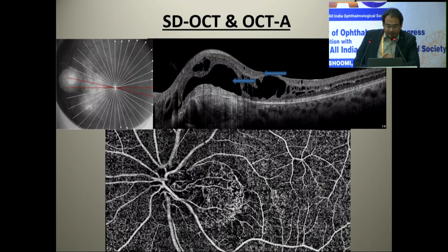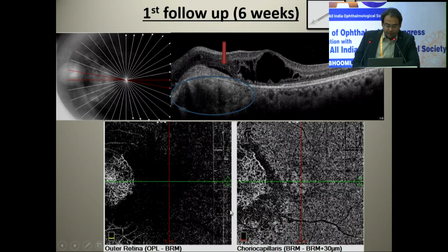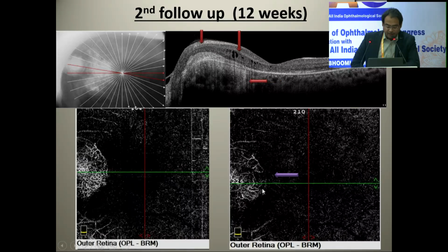This is my final case, a young girl having choroidal osteoma with CNV. This is again a published case. This CNV net can be documented beautifully with an OCTA. This girl was injected. After 6 weeks, some regression was noted, but not a lot. The girl was re-injected. And now you can see that in the outer layer, the net is regressing beautifully. This documentation of CNV net regression is also important because many times with injections these nets regress and you actually treat this. You cannot document this with FFA or an OCT.